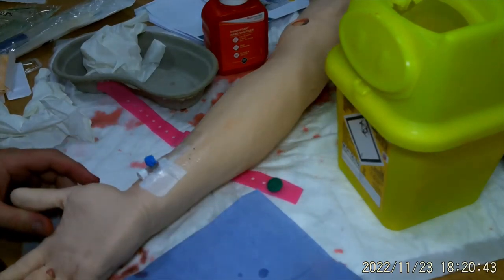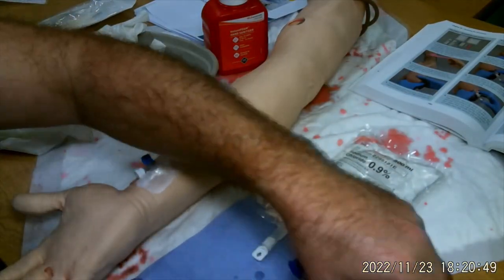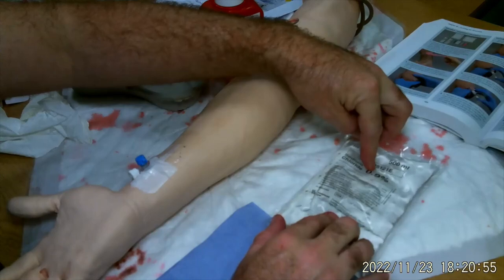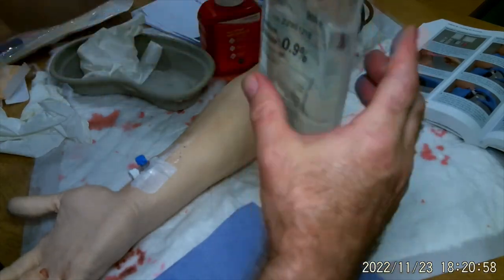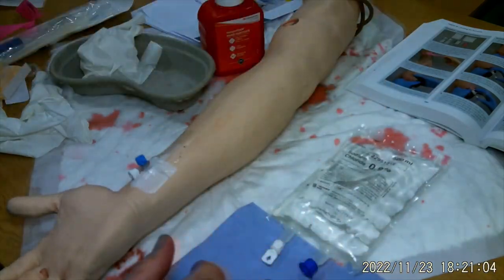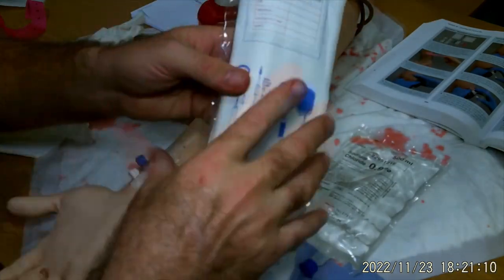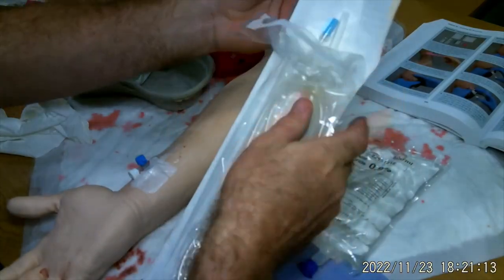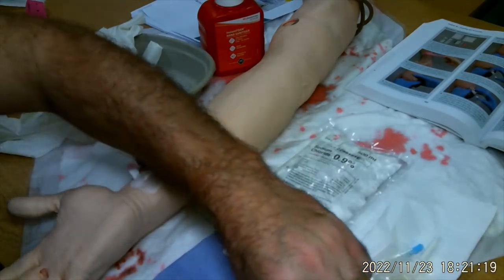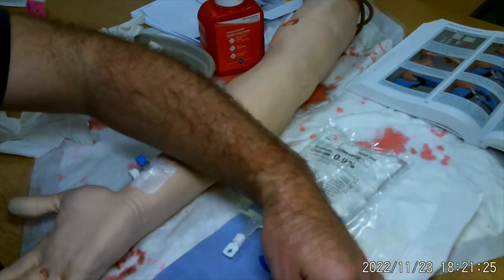Next I'm going to set up my fluids. We're going to check our fluids — always check the actual content, make sure it's the right drug, looking for any precipitation or bits in the fluid that shouldn't be there, and check the expiry date. Then do the same with my giving set — check the integrity of the packaging, check the date, and confirm it's the right equipment. I'm going to open this up and leave it on its own sterile field, then lock off the wheel completely.